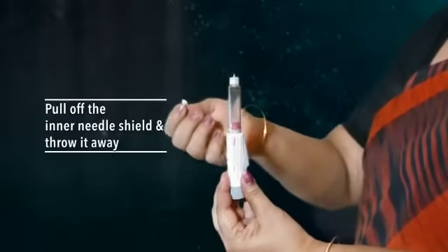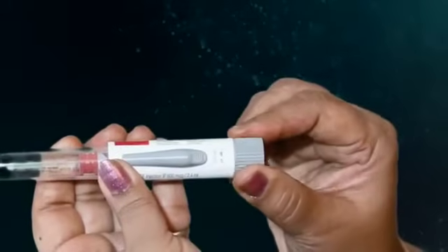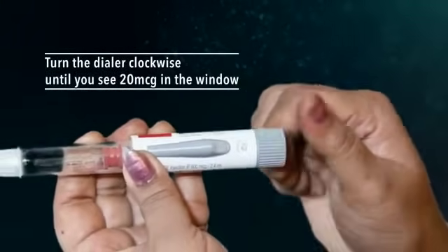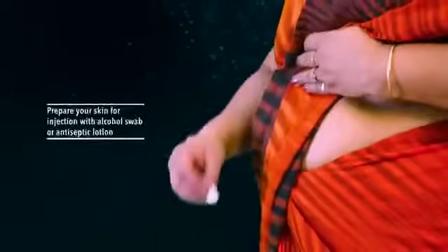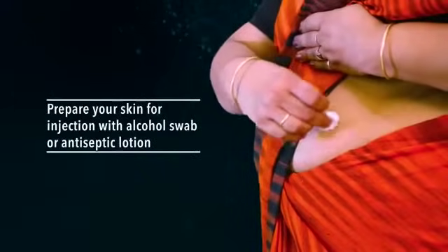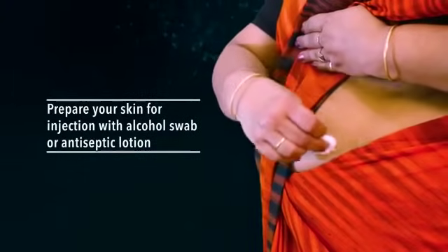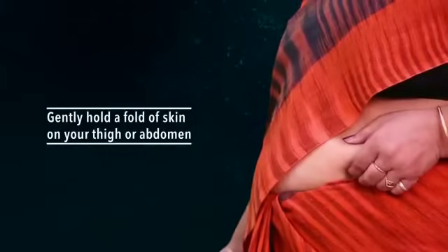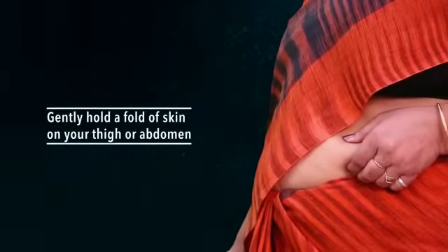Turn the dialer clockwise until you see 20 micrograms in the window. Number one: prepare your skin for injection with an alcohol swab or antiseptic lotion. Number two: gently hold a fold of skin on your thigh or abdomen.